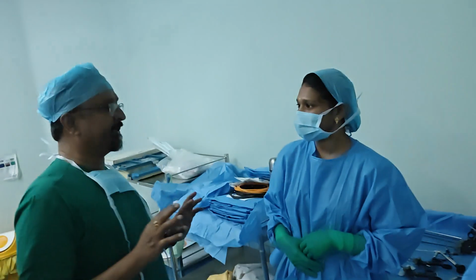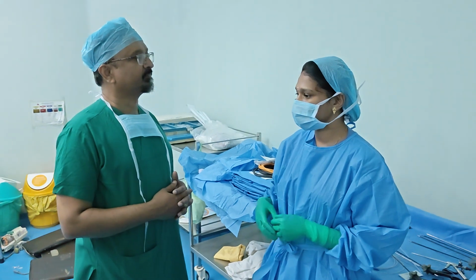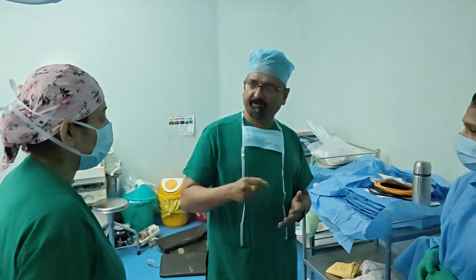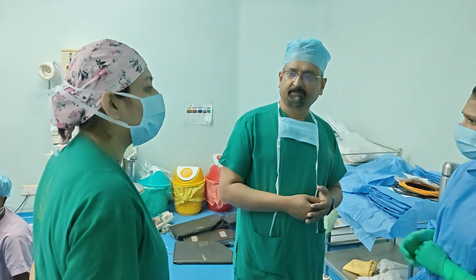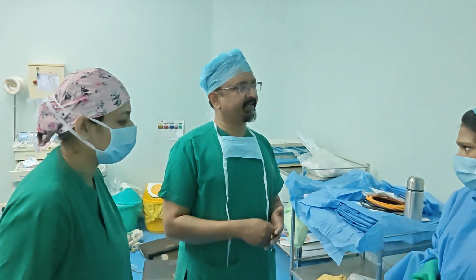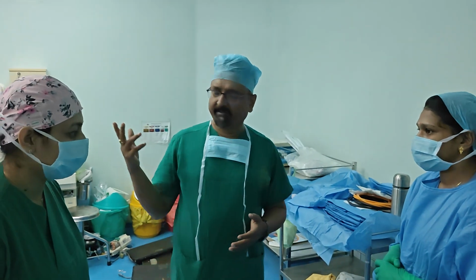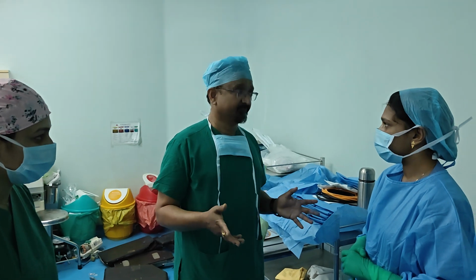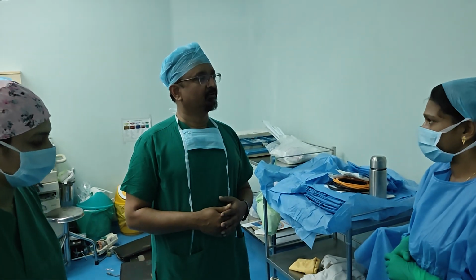Anything else you need to know on the day of surgery, like after the patient is induced, what do you check? Again, you have to check something. Pre-check, like when you do the time out, what are the things you check? One is the antibiotics, then the instruments. Side. So you always mark the side and check the side and then make sure that the patient is positioned accordingly. Then check that your instruments are working. And if your monitor or instrument is not working, what is the backup? So you need to have everything in plan, and only then will your procedure go very well.